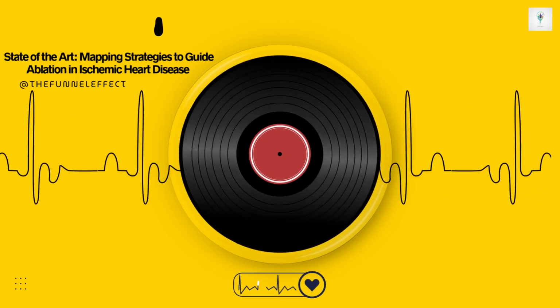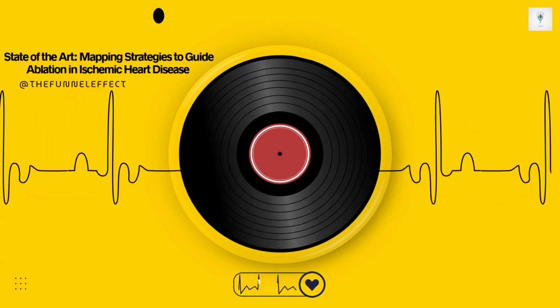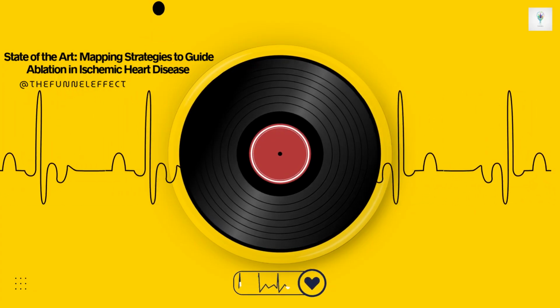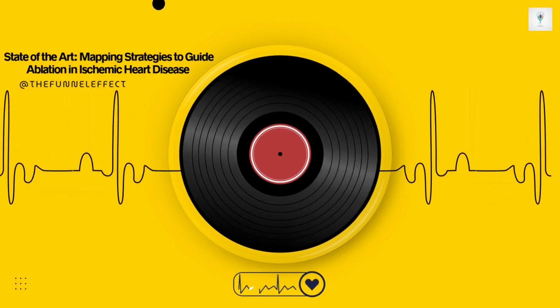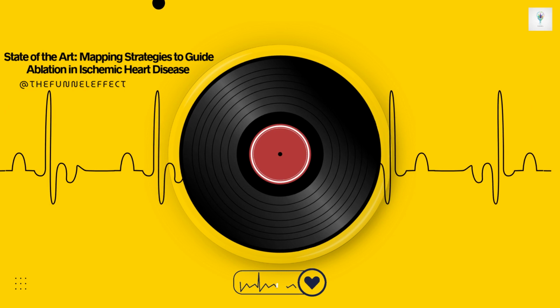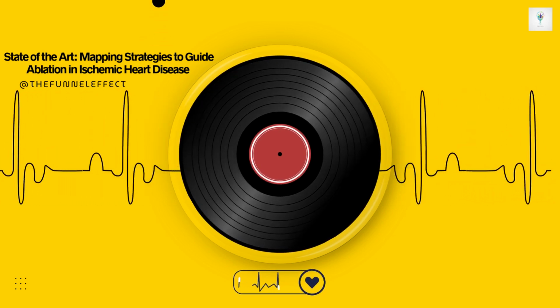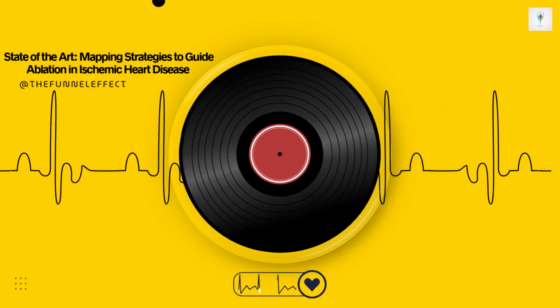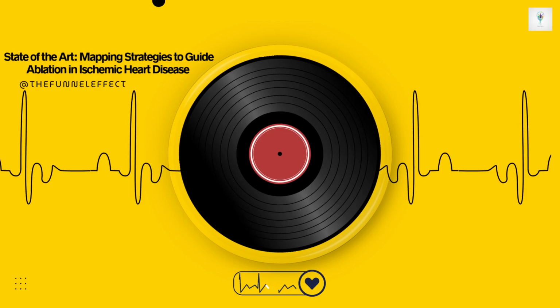We clearly need better integration of high-resolution imaging during the procedure to guide us to these deep targets. But perhaps even more critically, we need new ways to deliver ablative energy deeper into the tissue. Maybe more focused energy sources, non-contact ablation methods, or novel approaches to achieve truly transmural lesions reliably. Tackling the intramural isthmus remains the key frontier in ischemic VT ablation. A really important challenge for the future of this field.